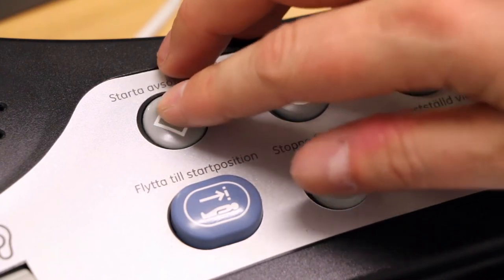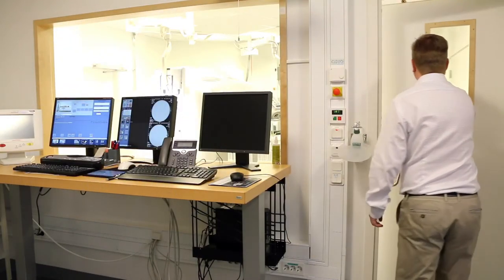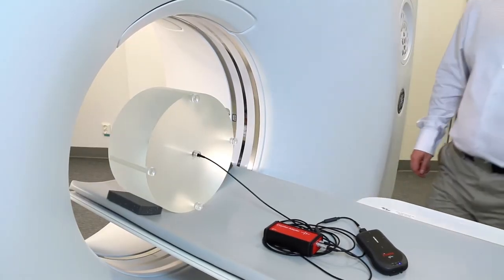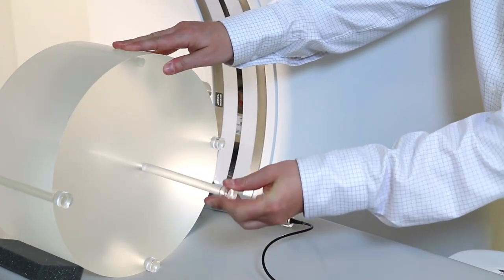Perform axial measurements in all five holes one by one: centre, 12 o'clock, 3 o'clock, 6 o'clock and 9 o'clock. All other holes must be plugged with PMMA rods. Make sure that the patient table is not moving during the measurements.